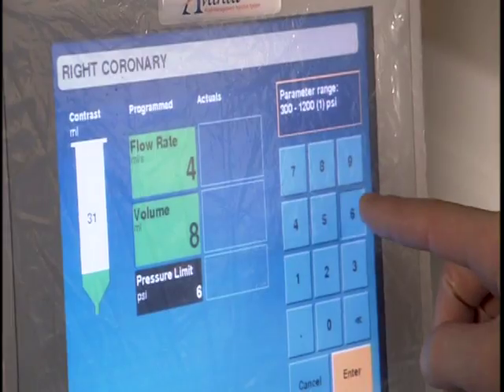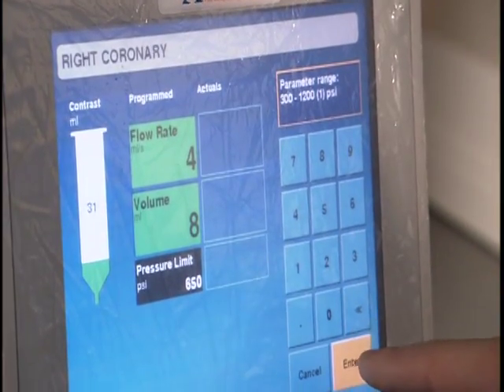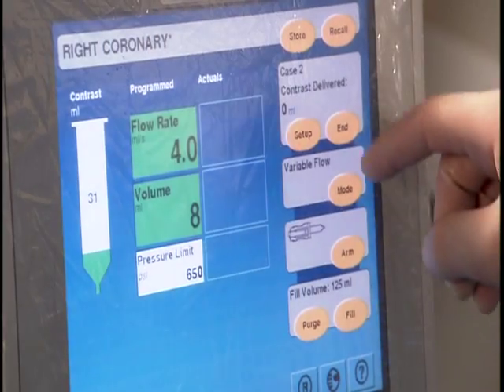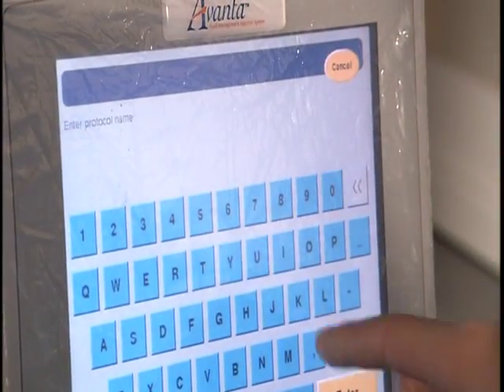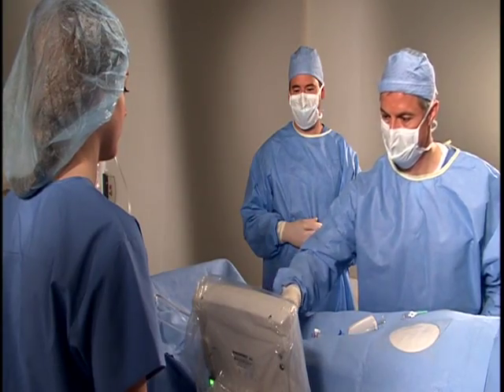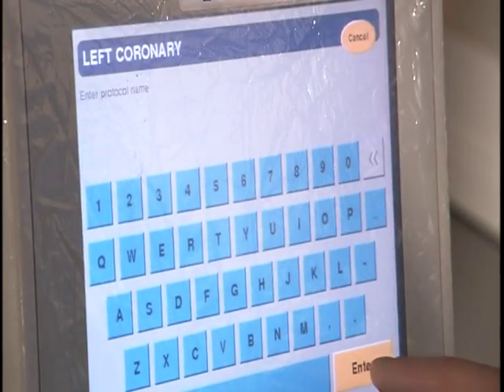If a protocol is recalled and changed on the main screen, an asterisk appears after the protocol name, indicating that it is no longer the stored protocol. To save the changed protocol, touch Store, type a new title, then touch Enter. The new protocol will be saved, as will the original protocol.